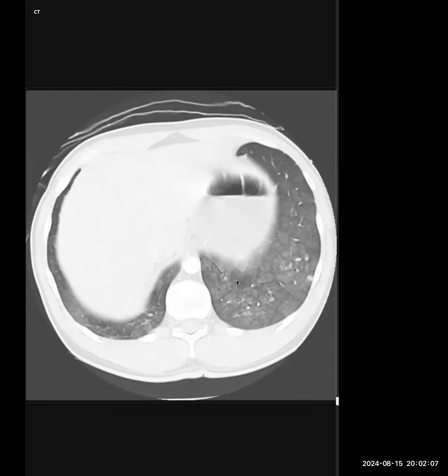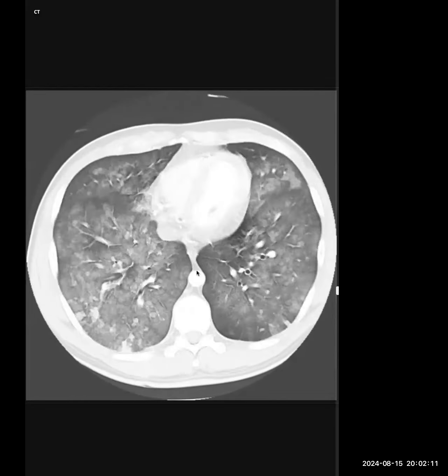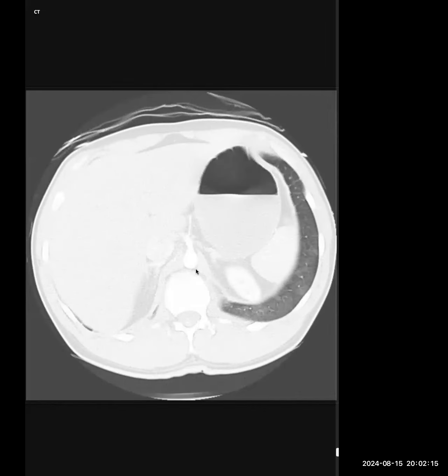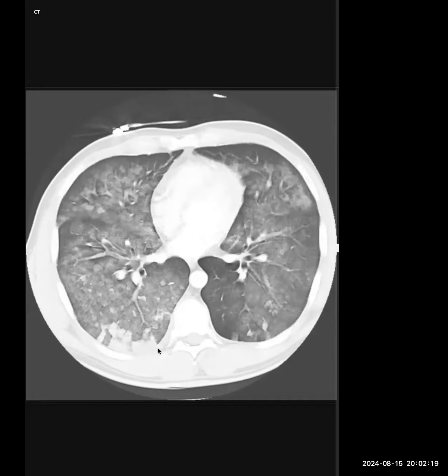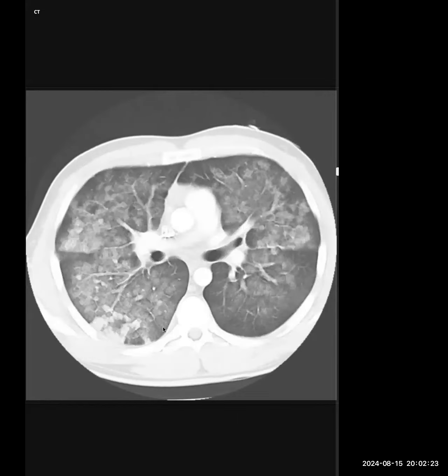But this is where you mentioned the management? Yeah, even in this case, you did not place a lot of stress on how you would manage this. It doesn't end with just I would inform the referring physician, right? So this is the case. This patient is very sick, you can see. So this patient is probably in the ICU.